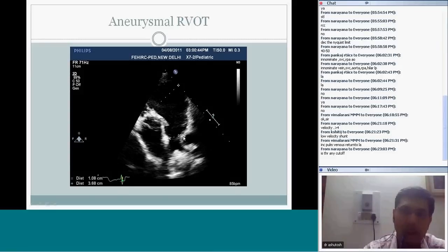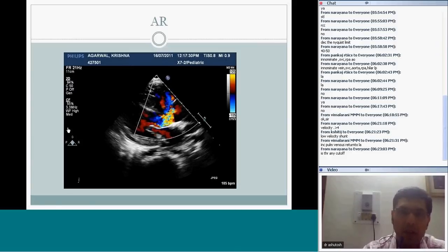This is what we look at. Look at this hugely dilated right ventricular outflow tract in the patient. That's the original MPA. So this is the result of free PR. We are lucky that nowadays most surgeons are not doing transannular patches. They are trying to minimize the use of transannular patches as much as possible and leaving some degree of RVOTO in the patient.